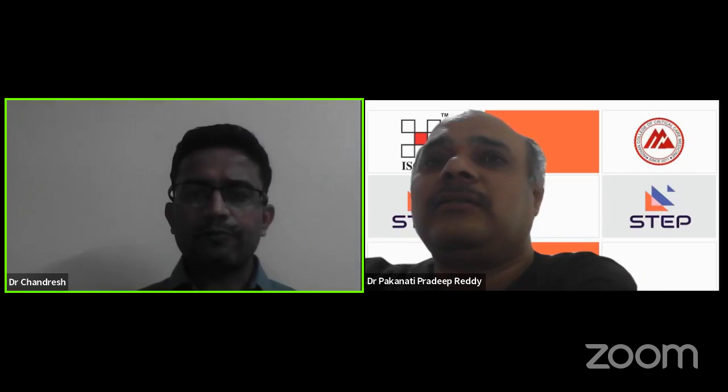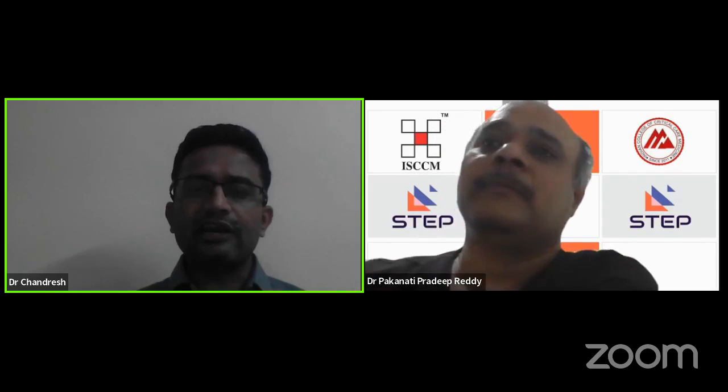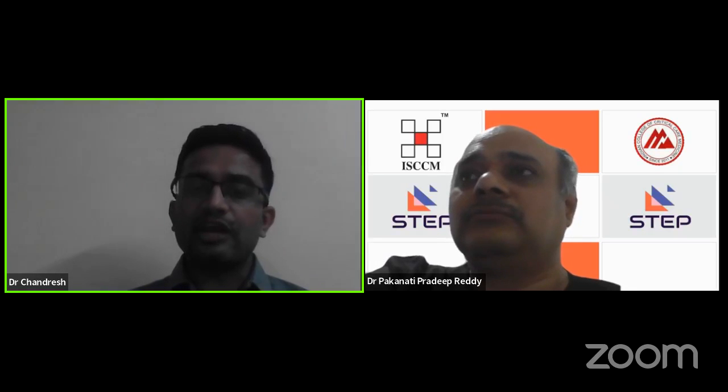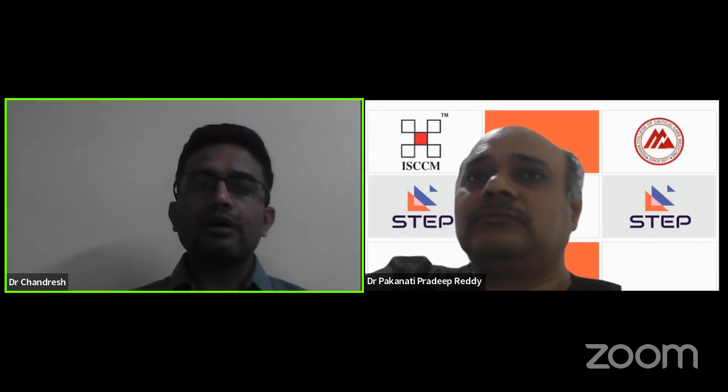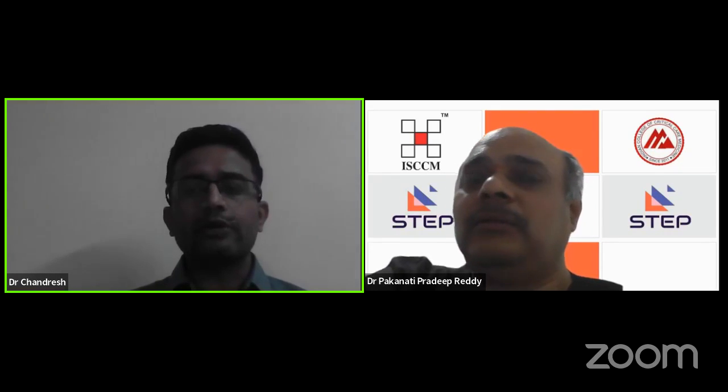So here there is no clear-cut demarcation number, but if you are ventilating such a patient with the lowest possible FiO2, you can keep up to 30%. The FiO2 which we can keep minimum on ventilator can be 30 or 40. But if you are thinking even lower, it means the patient at that point can be extubatable and might not require ventilator support at all. So the answer is maybe 30 or 40% FiO2, still you can go ahead.